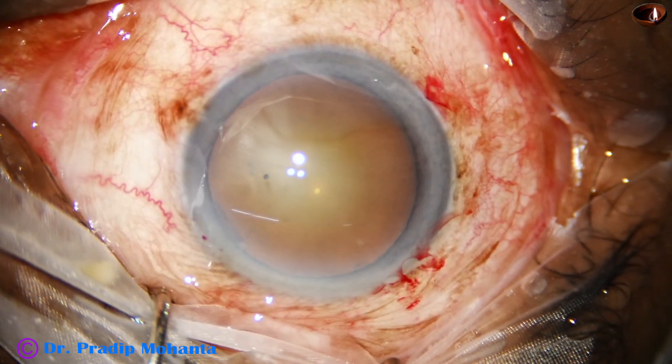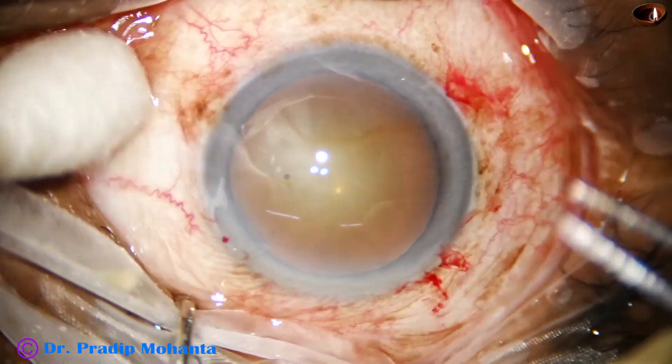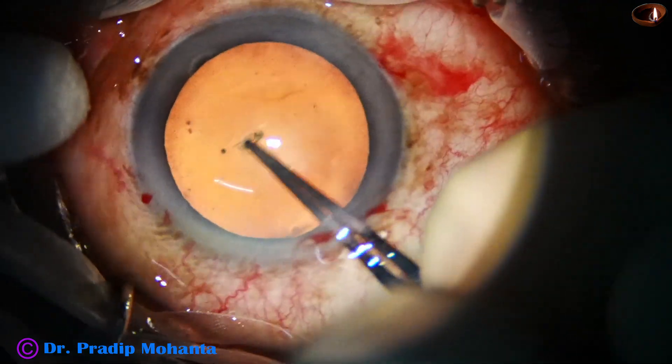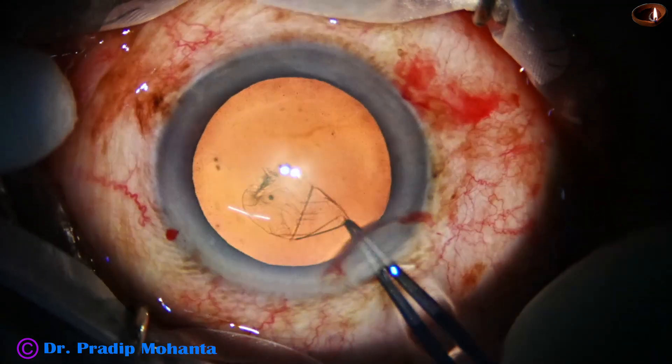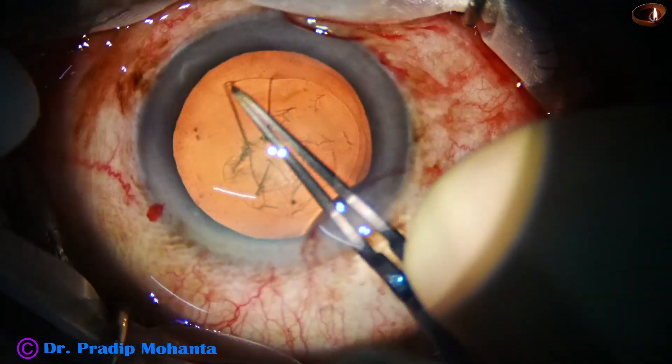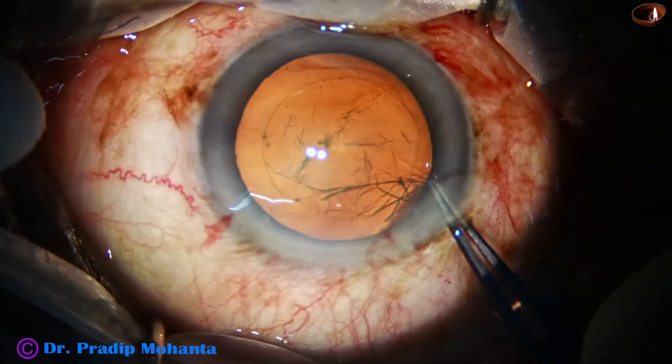Now is the time to do capsulorhexis. This is the Lumera T microscope from ZEISS having very good stereo coaxial illumination, and trypan blue dye is not required in most of the cases.